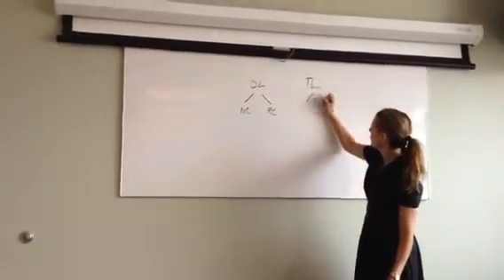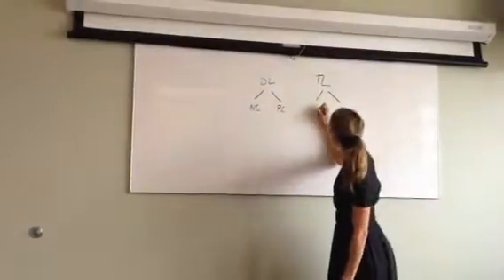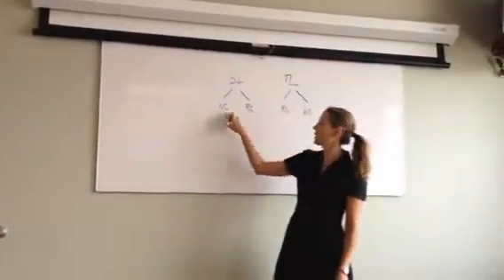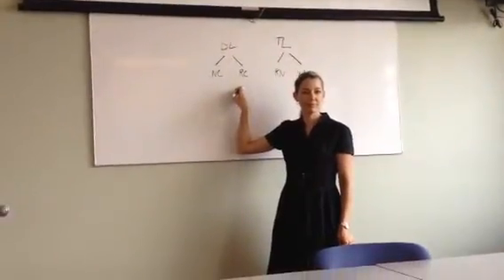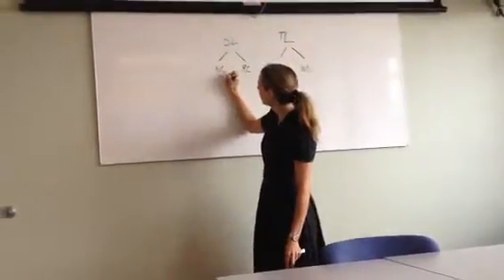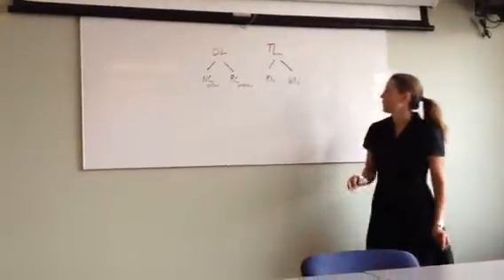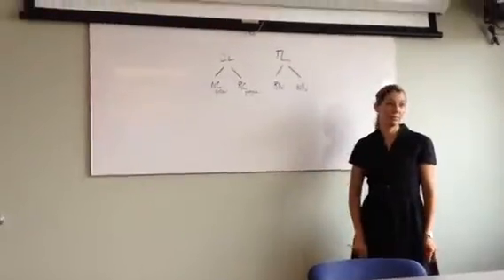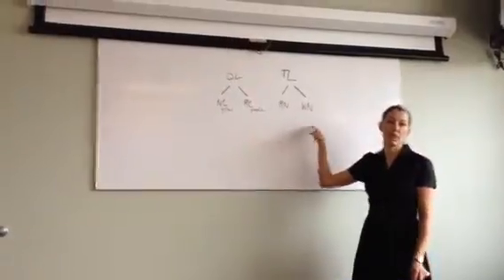What are the two restorative platforms for tissue level? Regular neck, wide neck. Yes. What are the colors for NC and RC? Gold and purple. I would say yellow and purple. I don't know if you remember, but the colors for regular neck and wide neck are all silver. Okay. So bone level, tissue level, NC and RC, and regular neck and wide neck.